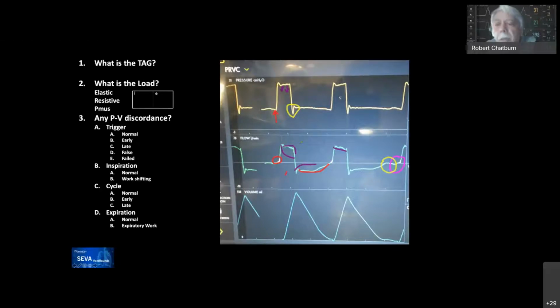I'm still not sure what you mean by time control. If you mean pause time? No. Wasn't there a feature on the servo that's supposed to make exhalation easier? What was it? The time gain controller or something like that they used to call it?